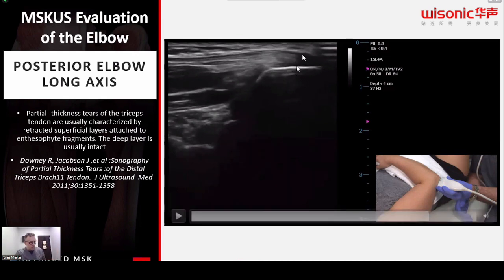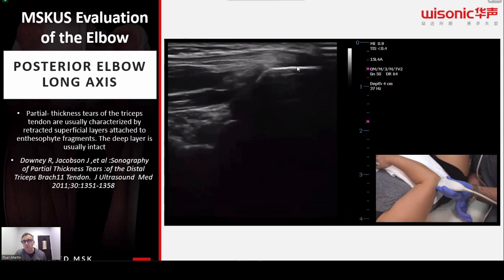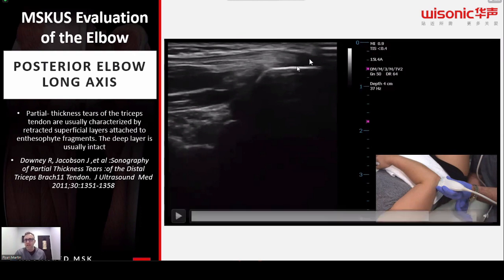a little clearer. Remember, one of the goals that we're doing here is tear or no tear, right? If somebody sent me this picture here, I would say, I have no idea. That could be a tear, probably not, but that could be a tear. Prove it to me that it's not. So your angles of incidence are really important in this area here. Don't call something that's not there, or don't miss something.